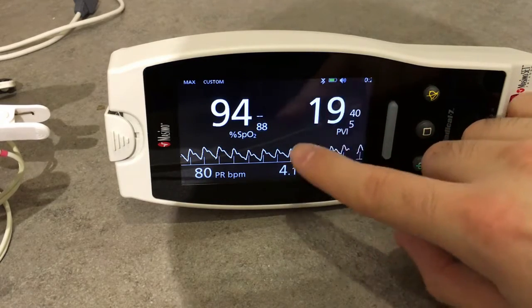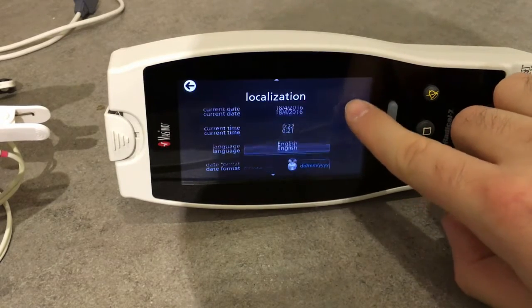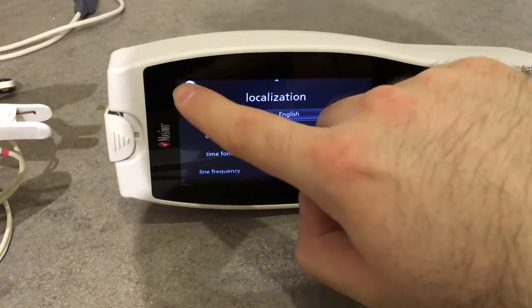Here we can set the date, time, language, and date and time formats.